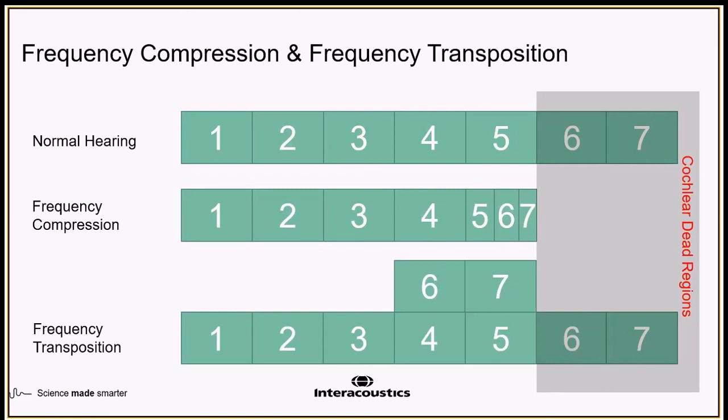But ultimately, if we increase the incoming signal, if we give them a higher signal to process with, we can then allow their auditory pathway to sort between that information as to how it's used. There is a lot of evidence to show that frequency compression, frequency lowering, frequency transposition is very beneficial to users. As long as it's optimized properly and controlled. I say that because I've seen it's very easy to just turn it on for everybody, but there's no knowledge as to how much of a benefit it's giving.